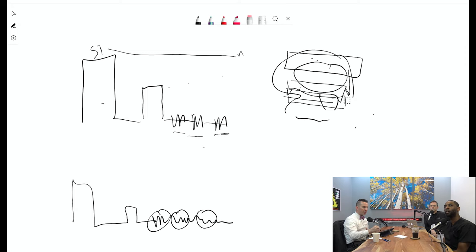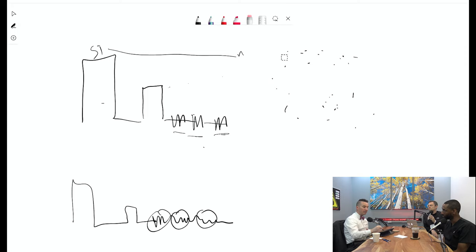And when it comes to really high resolution vessels, I think you just need to be very, very mindful of your compressed sensing factor, just to make sure that the iterative reconstruction is not guessing too much. You want to still give it a core amount of data.